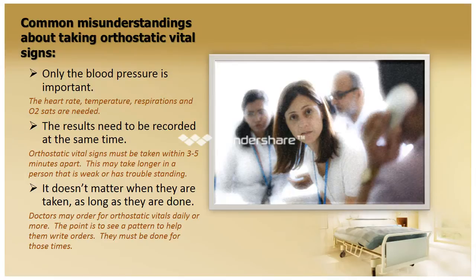So let's discuss some common misunderstandings about the orthostatic vital signs. Typically, we often hear the top three. The blood pressure is the most important or the only one that is needed. The time needs to be recorded at the same time, or it doesn't matter when they're taken as long as they're done. All of these are incorrect. The Institute of Medicine states that the heart rate, temperature, respirations, and SATs are also needed to be attained. Now, the physician may not exactly write the order that way and just want the blood pressure, but for the sake of your floor, leadership may want you to have all of those vitals recorded, and we'll discuss a little bit more about how to do that later.